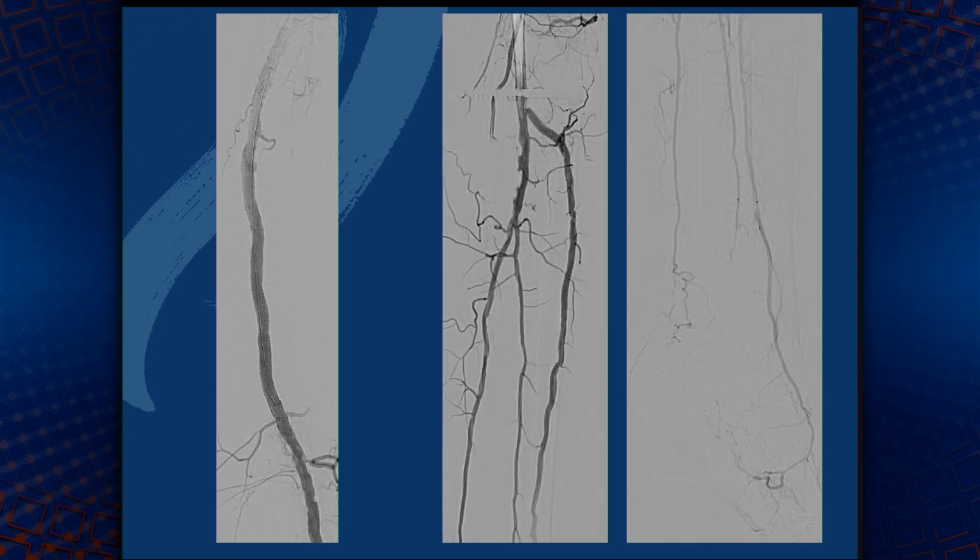And here was the result. We are quite confident with it, and there's still good outflow without any distal embolization as well.